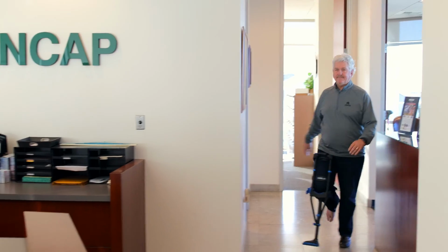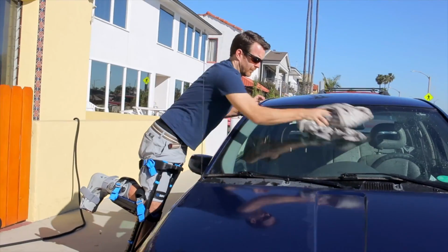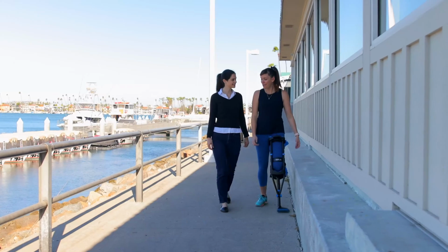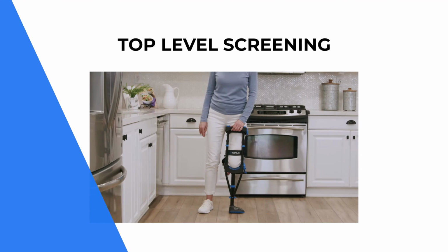Qualifications for use. The iWALK crutch works for most people, but it's not for everyone. Your first responsibility as a fitter is to determine if your patient meets the requirements for use of the iWALK crutch. Start with these physical abilities tests. These two tests can quickly qualify or disqualify your patient.